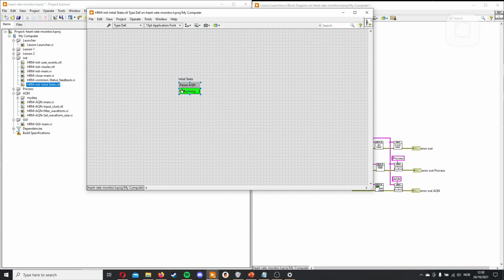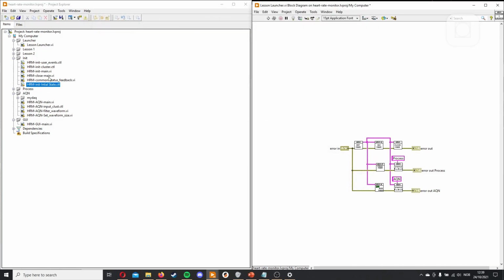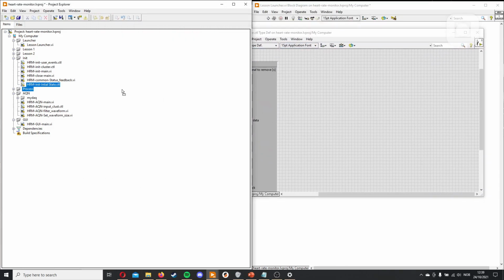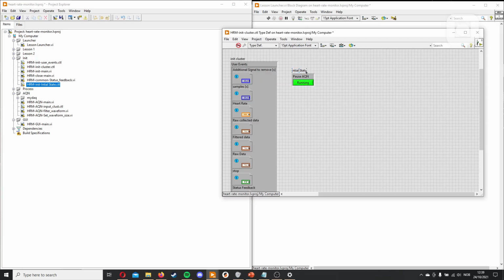So usually this would probably be some sort of configuration file which decides certain values. But this is not needed for our small application. But when you make a larger application, just having a file where you read the initial values, maybe some device information, would be helpful. And we want this cluster to go into this cluster.